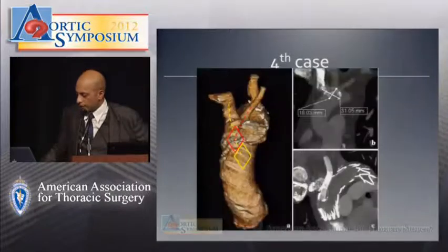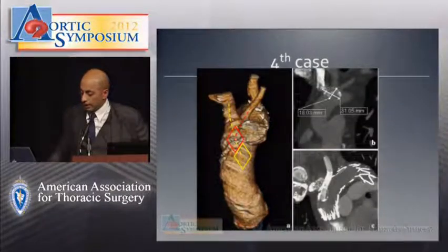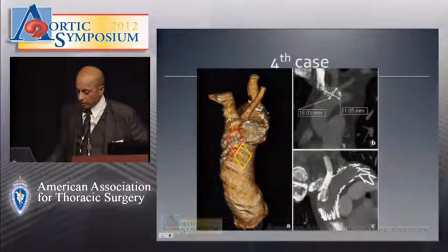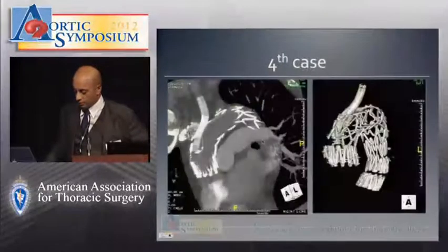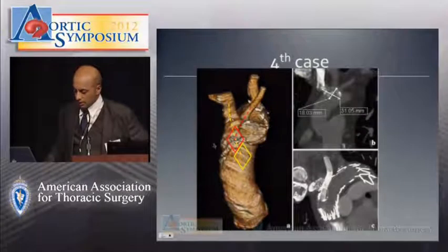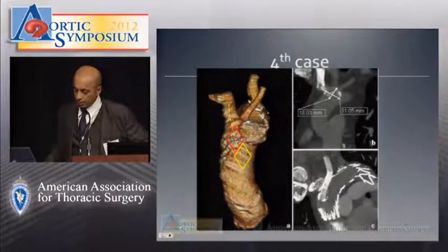But we decided that this would be a patient that we would do, and during that last third case, this one was being planned, and again we thought a bit too hard about predicting the cannulation path from the supraaortic vessels, and this proved to be a real problem in this particular patient. And you can see, in hindsight, it's very easy to see why we wouldn't have seen that it would be difficult to come from the innominate artery and get into this particular branch over here.